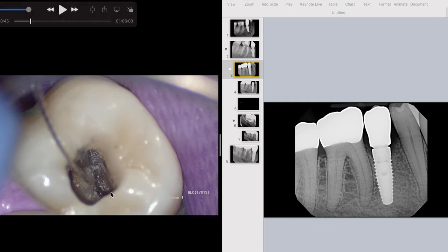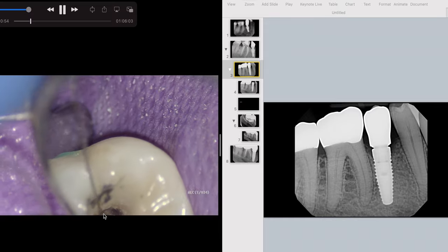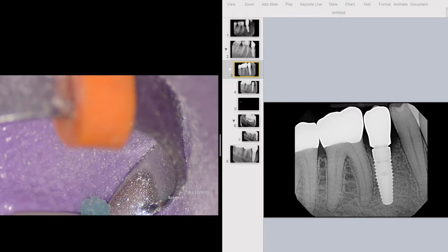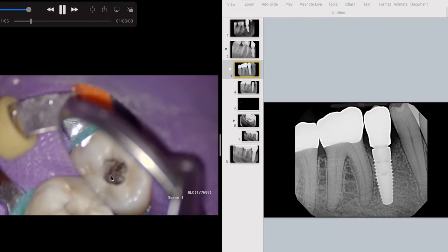Now we can triangulate. I've got to remember the crown may not be perfectly centered on the tooth, and the tooth might be rotated. I've been burned before by assuming no rotation. I'm going to assume the other orifice is somewhere under here and also triangulate to find the distal orifice. I'm troughing along the mineralized pulp tissue — stained dark — not going deep, going lateral. What I'm looking for is that mineralized pulp tissue along the distal lingual corner.